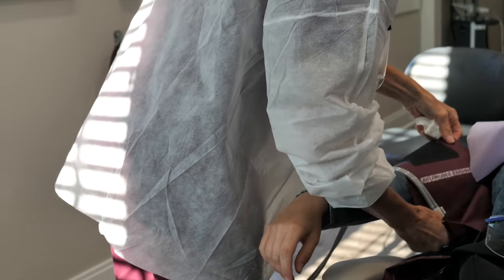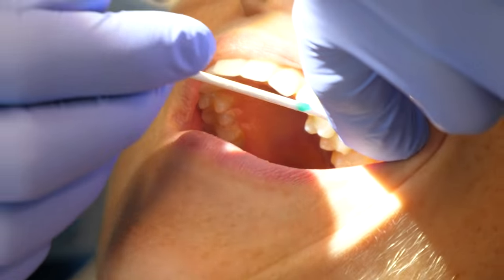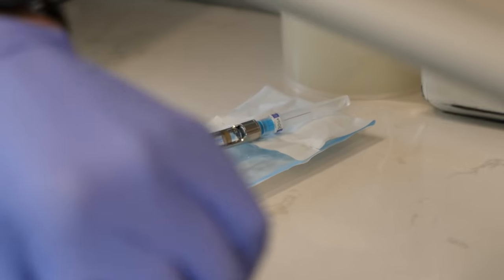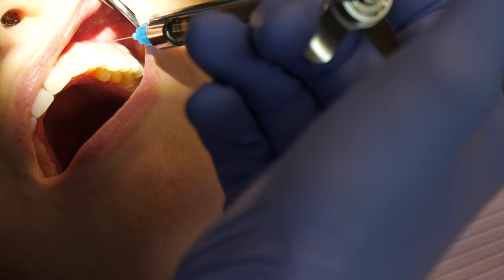First, the dentist or the dental assistant may take your blood pressure prior to numbing you up. Next, they may apply a topical anesthetic on your tissue so you won't feel the pinch from the needle. Then you may receive local anesthetic.